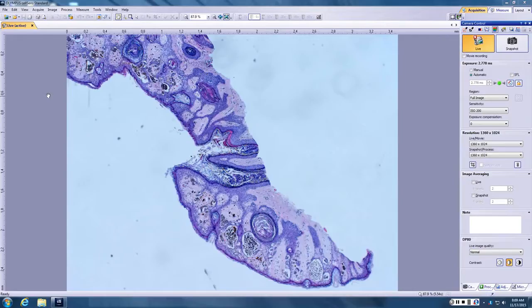This would be a typical 12-year-old kid, and the lesion itself, you took it off because it was 1.2 centimeters. Now you're going to go back with a margin in a kid's scalp. These are big excisions for completely benign lesions.